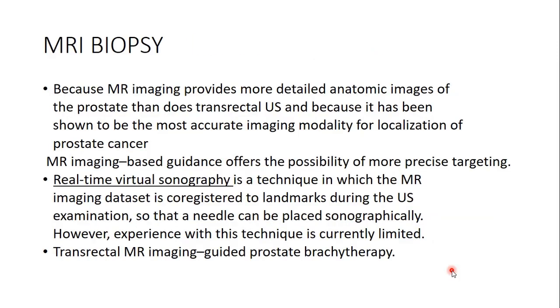Nowadays, MRI is also used in developed countries for guiding biopsies because MRI provides a more detailed anatomical image of the prostate than transrectal ultrasound, and it has been shown to be the most accurate imaging modality for localization of prostate cancer. Nowadays, MRI fusion biopsy is quite famous. In this, MRI is performed 1 day prior to the biopsy day. On biopsy day, the software is used to fuse the MRI scan with the transrectal ultrasound, and targeted biopsies are performed.